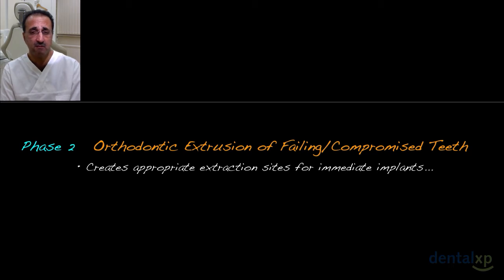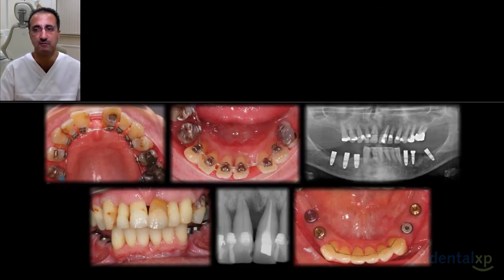And of course, we move on now to the second phase of the treatment. We're carrying out orthodontic treatment now to align the teeth and also to gently extrude and retract the upper anteriors. And this is the idea here, to bring the bone to a more flat architecture, to bring it down, extrude what was at a much more apical level to bring the arch into a more uniform position. And you can see that we have had some regain of bone around these teeth as we've treated the periodontitis.